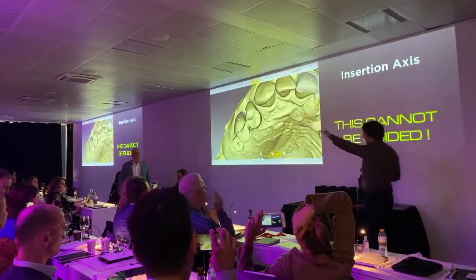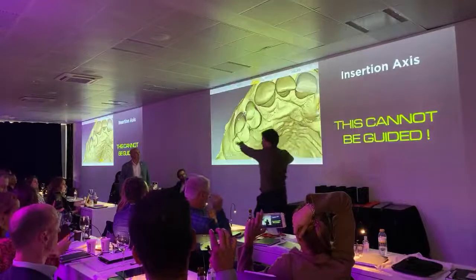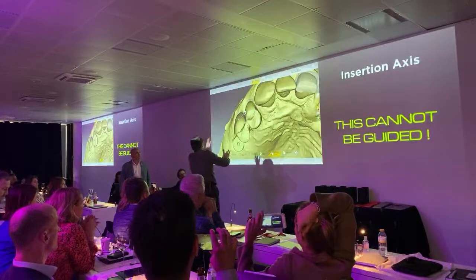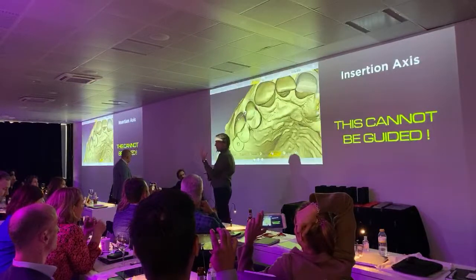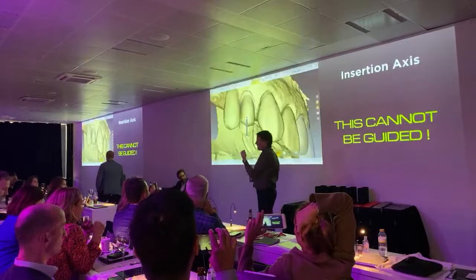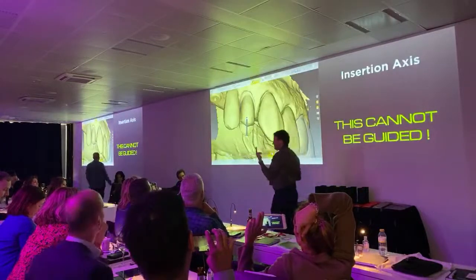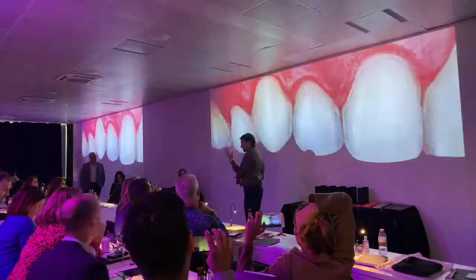When you look at your scan, on your iTero or whatever other scanner, you need to look tooth by tooth and ask yourself 5 questions. Do I have path of insertion? Do I have undercuts? Can I see the finishing line? Do I have clearance? Do I have sharp angles?